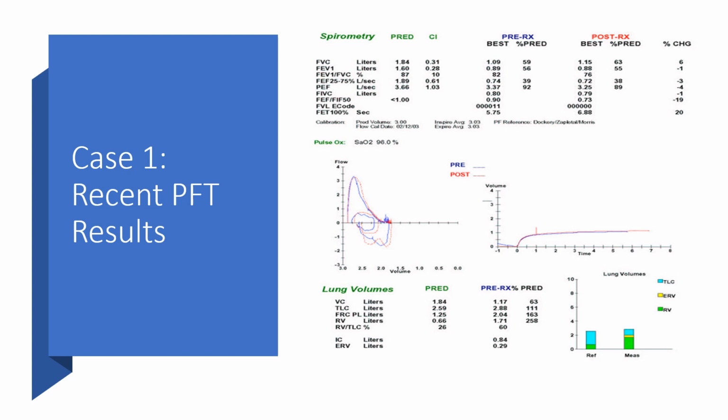So what we're taking home from this is the vital capacity. The funny thing is it's a vital capacity, so it's really volume over time or a flow. It gets a little bit confusing. But the balance of them, total lung capacity, residual volume, etc., are all above normal. And we'll talk more about that when we interpret it.